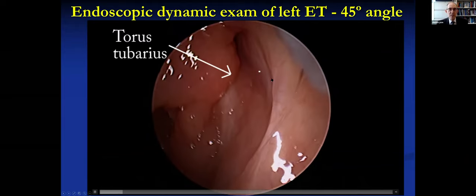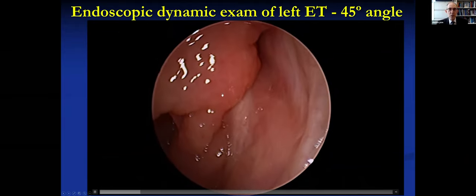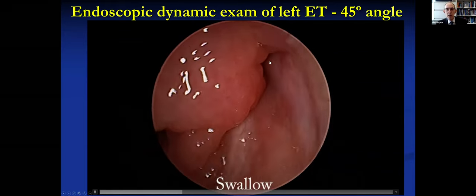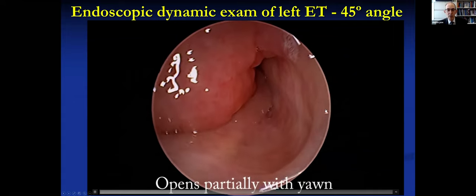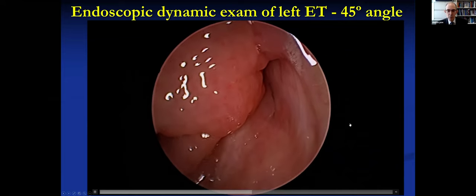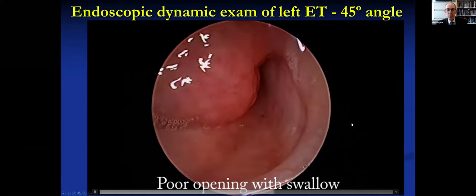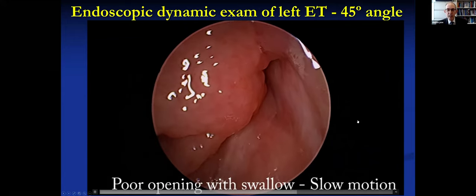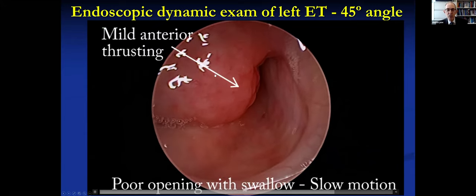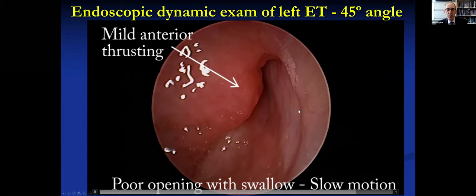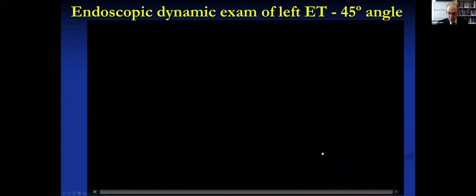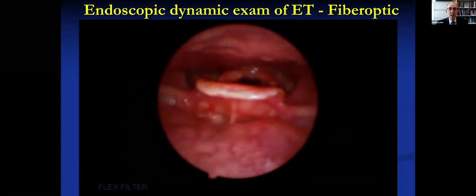Here's what that looks like on endoscopic exam on the left side: the torus is big with cobblestoning and lots of inflammation. There's the 'ca ca ca,' and here's the swallow — not great opening; it opens only partially with bulbous, pale edema. In slow motion: here goes the levator, and this torus is thickened and is being thrust anteriorly, partially closing the valve at the time it's supposed to be opening.